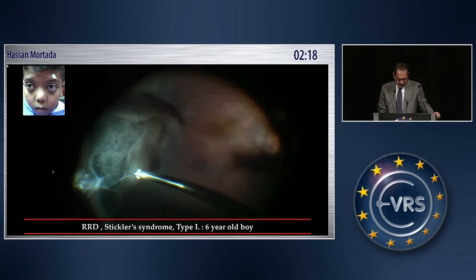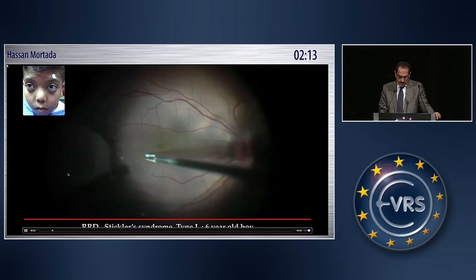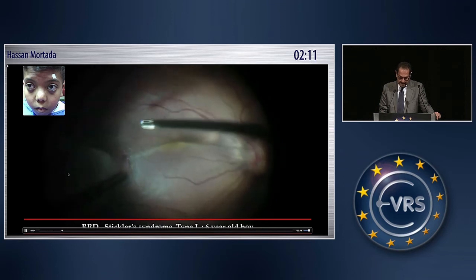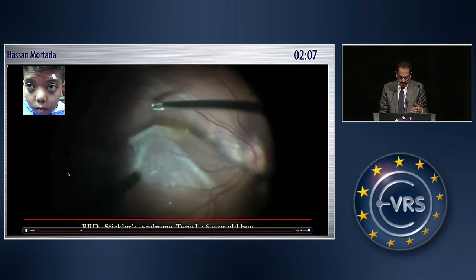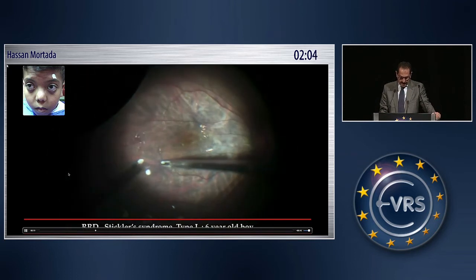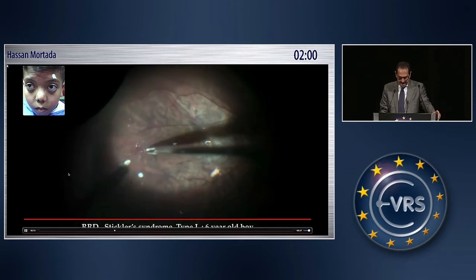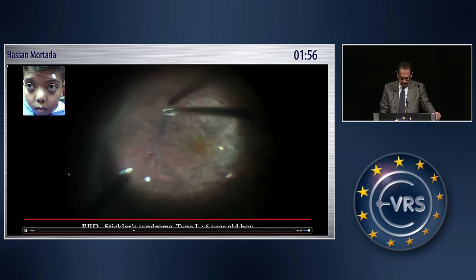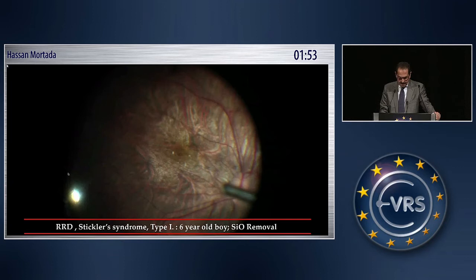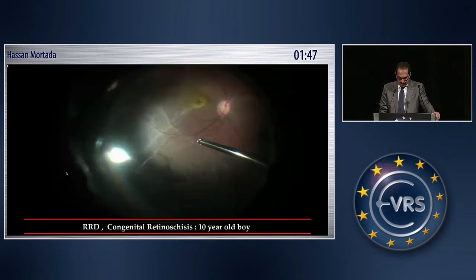This is another case of Stickler syndrome. The ILM was peeled first without PFCL, because usually the contrast in these cases is poor, and you may re-stain and then peel the ILM as far as you can, but not as extensively as in the previous case. This is at the time of silicone oil removal — the macular area is completely free except for some proliferation on the nasal side.